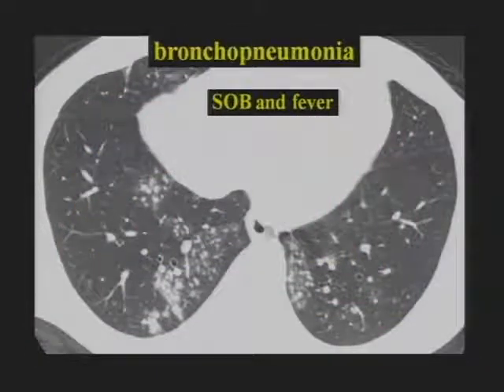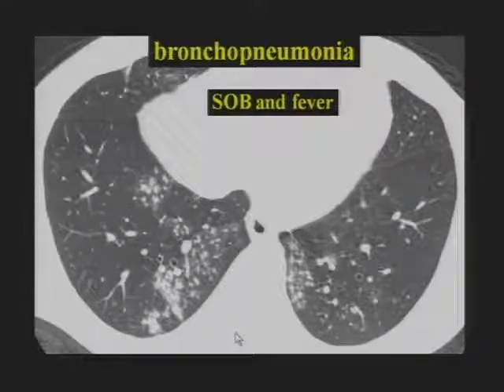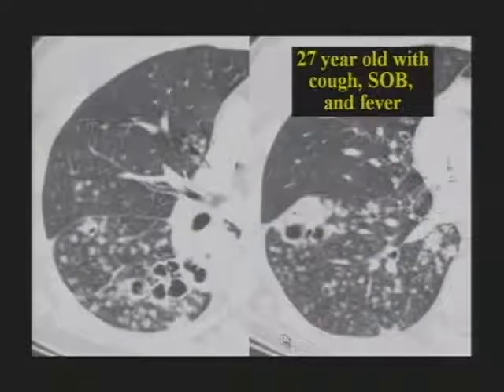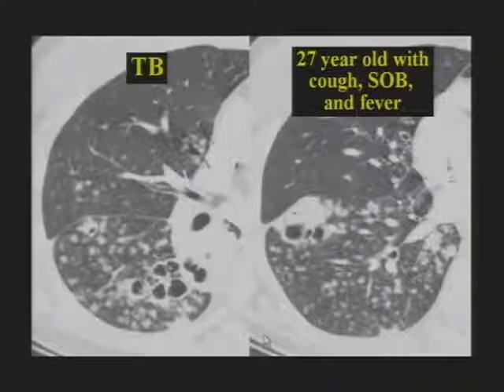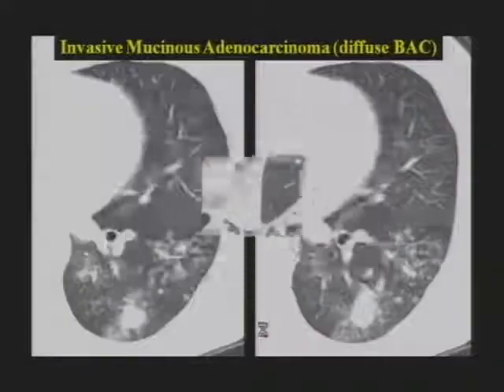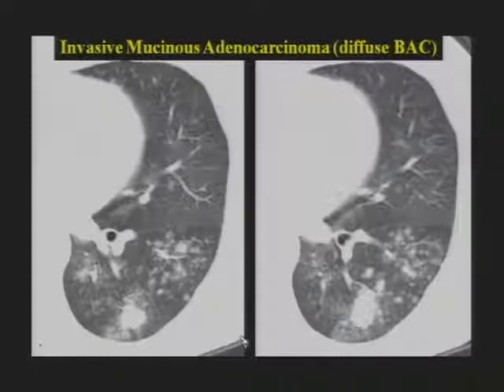A patient with bronchopneumonia, shortness of breath, and fever shows centrilobular nodules of soft tissue attenuation — infection is high on the differential when you see centrilobular nodules. A 27-year-old with cough, shortness of breath, fever, a few lower lobe cavities, and centrilobular nodules — this is endobronchial spread of TB. Another patient shows invasive mucinous adenocarcinoma with centrilobular nodules due to endobronchial spread.